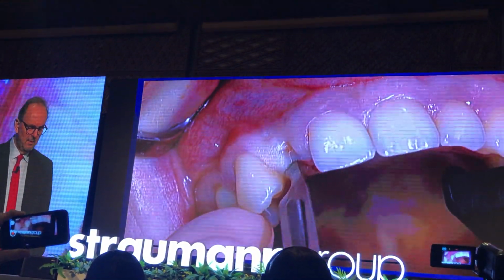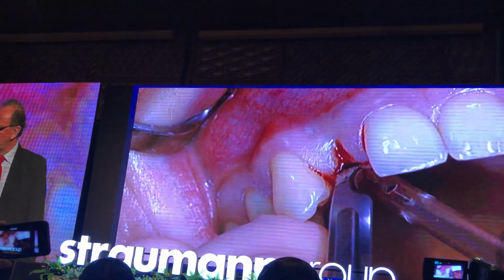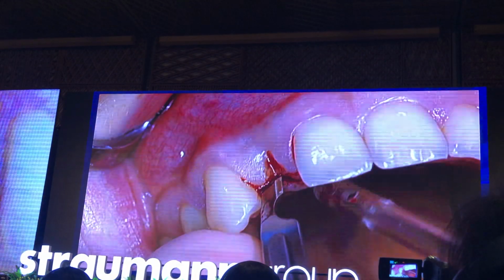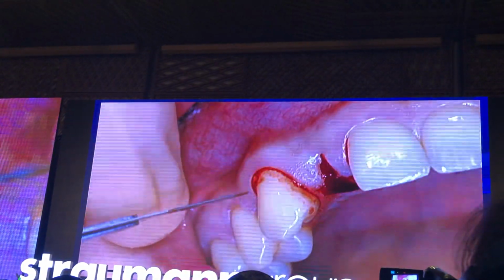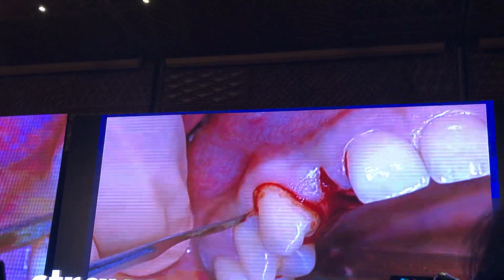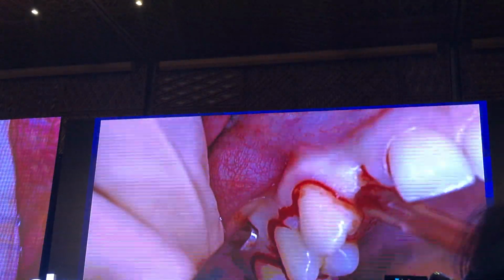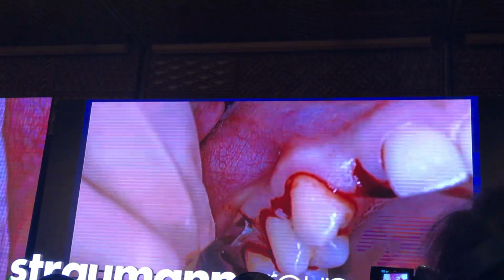The blade is introduced deep into the socket towards the inner, to allow mobilization of the soft tissues inside the socket as part of the full thickness flap. A sulcular incision is extended around the canine, followed by a papilla-based incision between the canine and the first premolar. The vertical releasing incision is applied as a distal line angle incision at the first premolar.